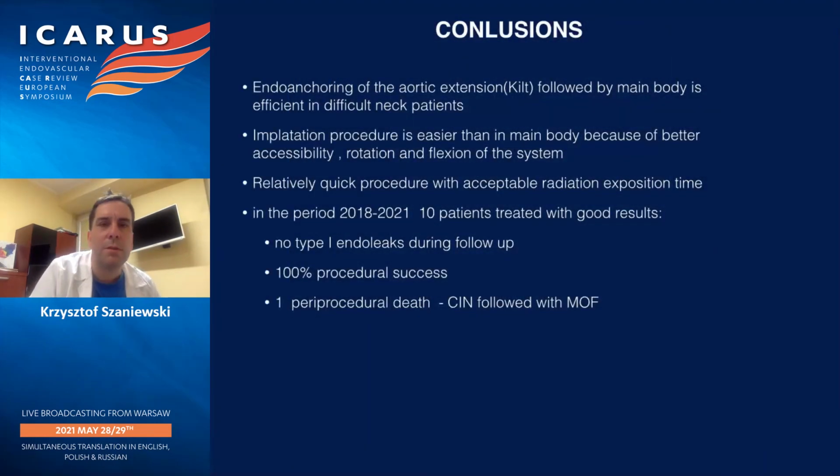So let's finish this short presentation with the conclusions. The kilt technique is very promising in difficult neck patients. As of now, we have 10 patients treated with the kilt technique together with EVAR, and we have really good outcomes for the patients. Of course, they are still under observation, but I encourage you to use this technique. And of course, welcome for discussion.